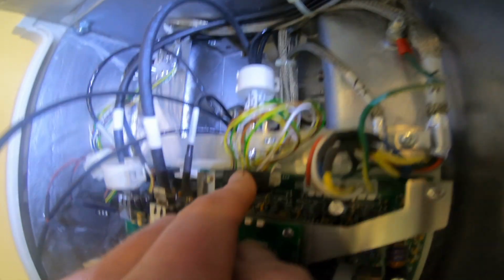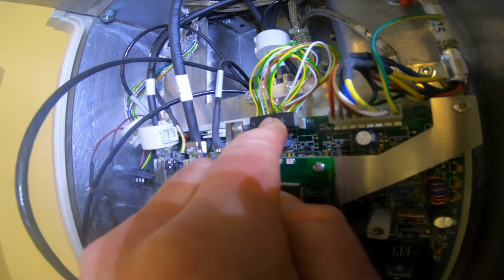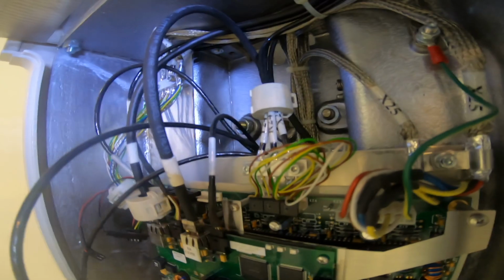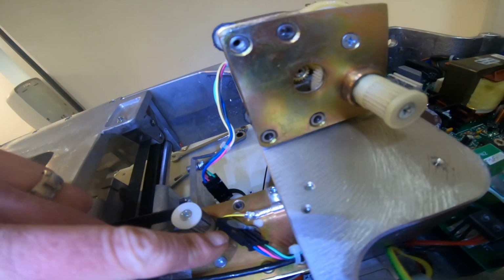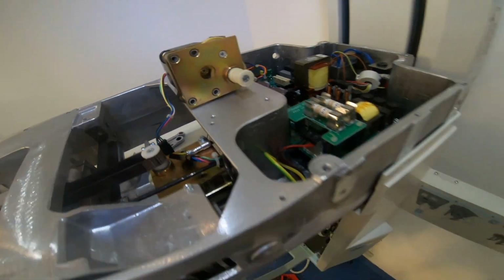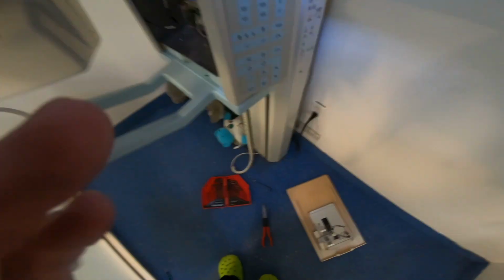So I'm going to test 2 things. I'm going to test an existing known good motor, which is hooked up to the belt, and then we're going to test that same motor that just didn't work. So right there is the Y connector, and right now that's running to the R pins. So I have to tell the machine to move the R motor, even though it's really the Y motor.